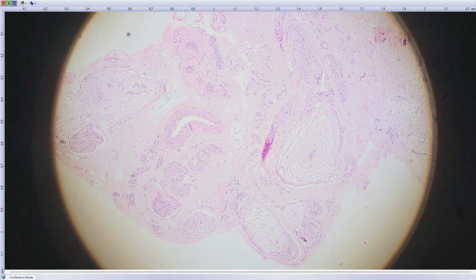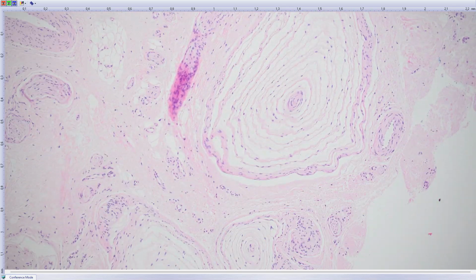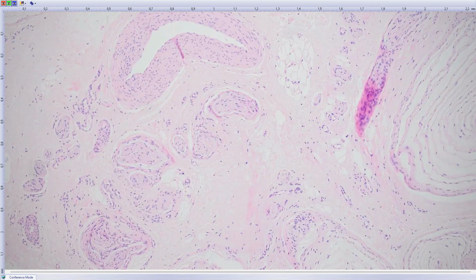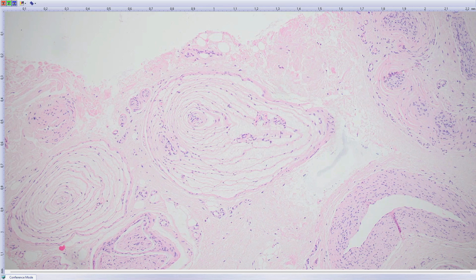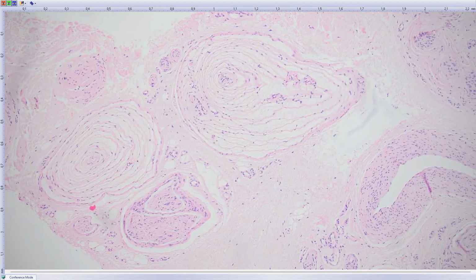He had some swelling on his finger, which was painful, and we can see why it was painful, because we see these Pacinian bodies, but these are not normal, they are more numerous and bigger, they are edematous, and we can see also some fibroproliferative changes around the small nerves, and the lesion is called Pacinian neuroma. Okay, so, don't play guitar. Now probably he's fine, because excision is curative in these cases, and he can continue with his guitar playing. So this is Pacinian neuroma.